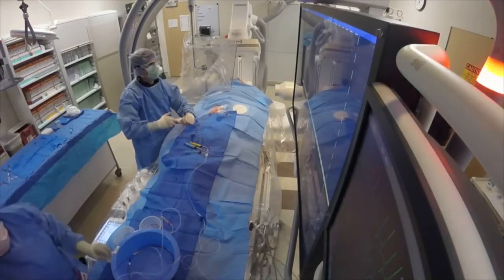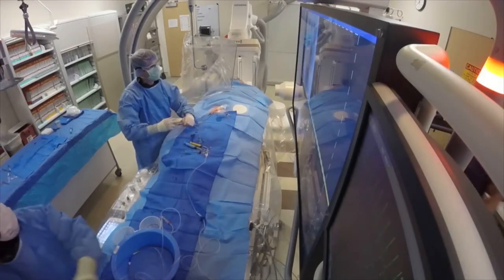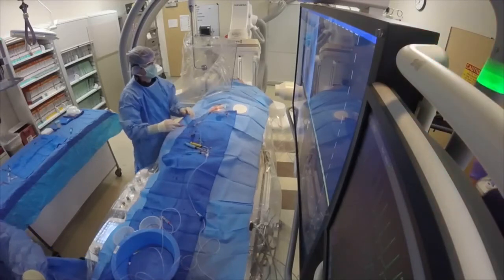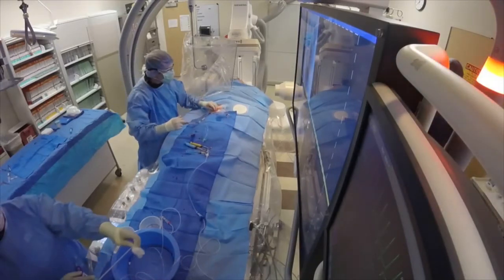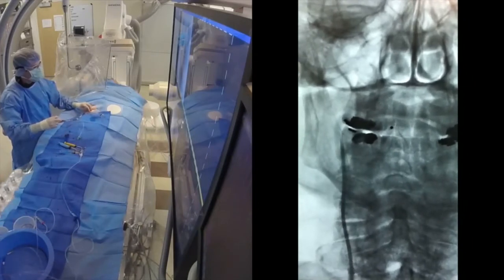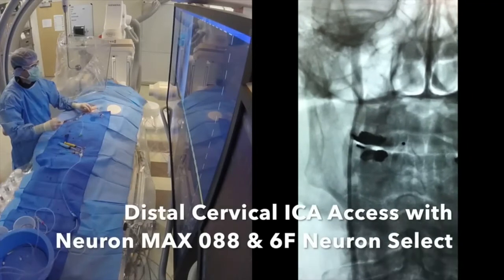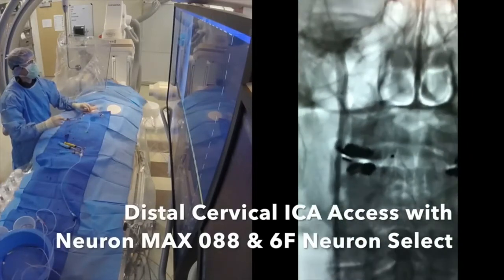At this point we're setting up for a run or angiogram of the head and neck, trying to identify exactly where the blockage is. The first thing we do is inject contrast through that main catheter into the carotid artery on the right-hand side, and that lets us visualize exactly where the blockage is.